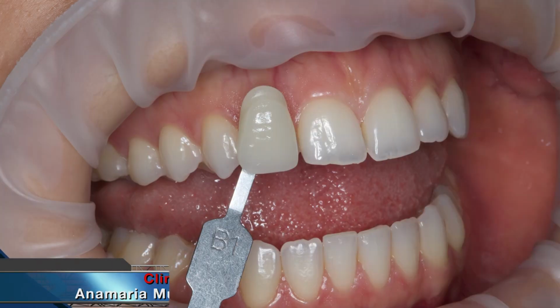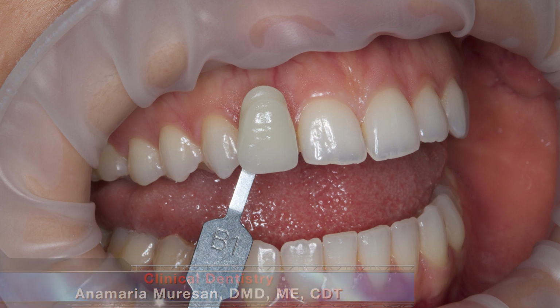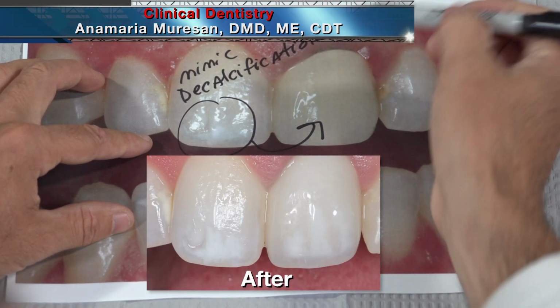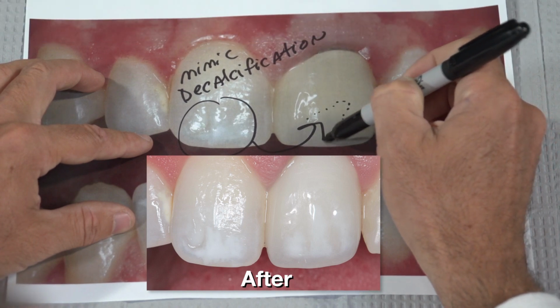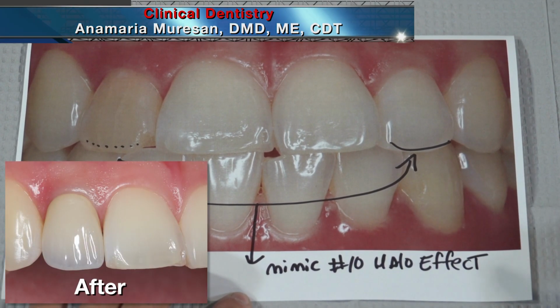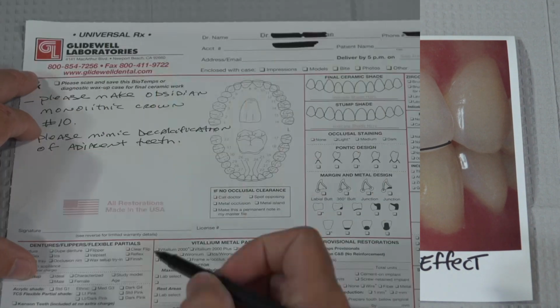So we've now collected enough data and photographic evidence to complete the RX form and submit for fabrication. Now my doctor has asked me to print photos that we have taken, if they are useful, and attach them to the RX form. Think of your photography as a secondary RX form, and don't hesitate to draw specifics onto them to get your message understood. Get detailed and point out things such as halo effects, decalcification spots, and any other anomalies that will aid in a lifelike restoration being fabricated.